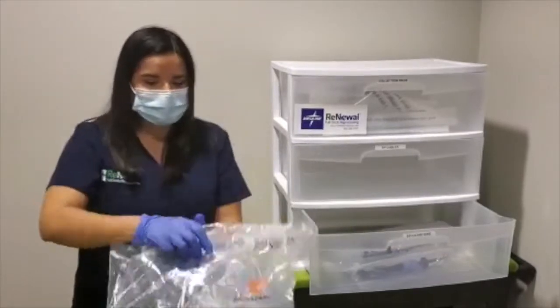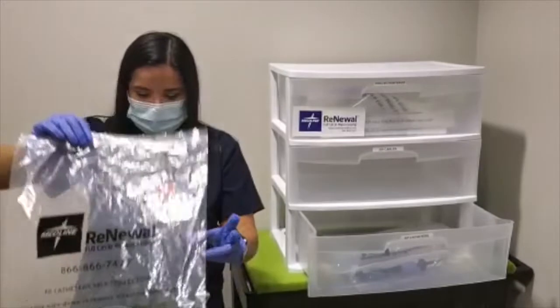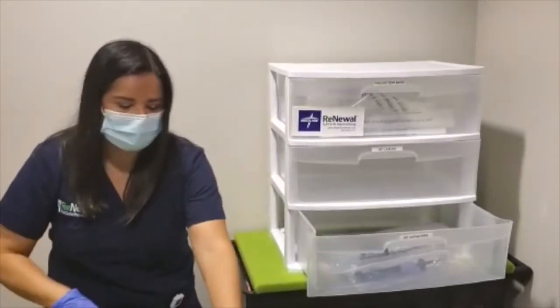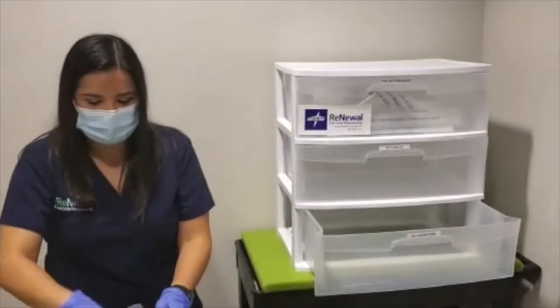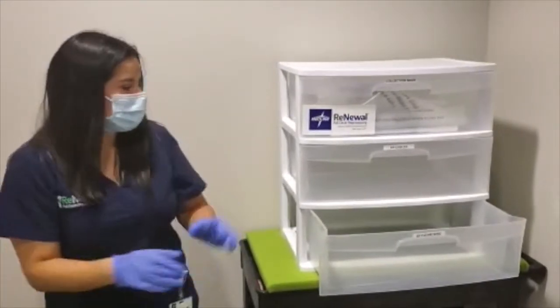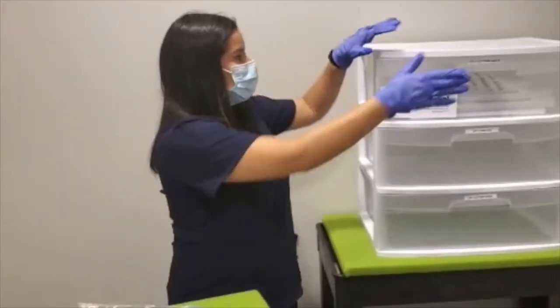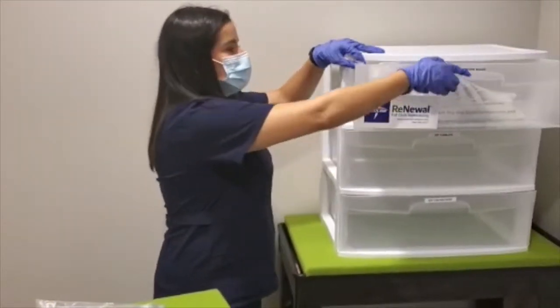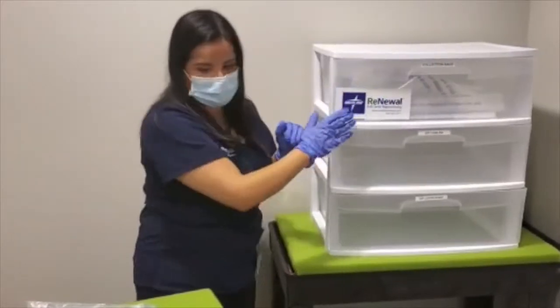Grab your collections and make sure that they are lightly coiled and bagged. If you need to re-bag or recoil anything, feel free to grab any additional bags from the collection bag door that we have for the facility.